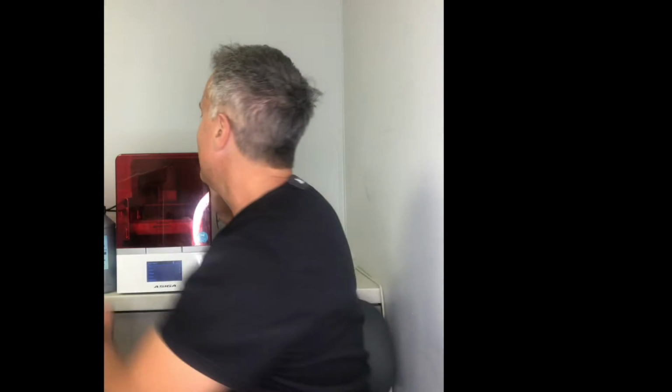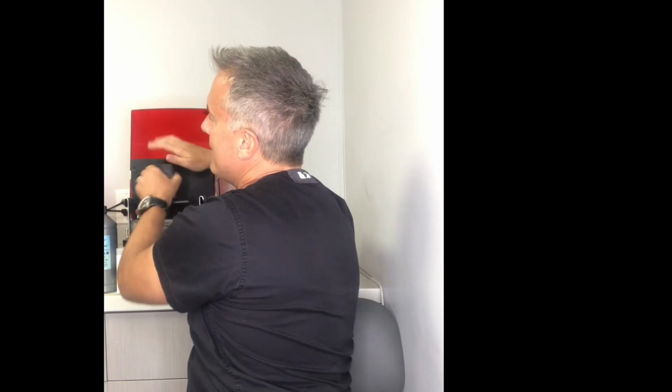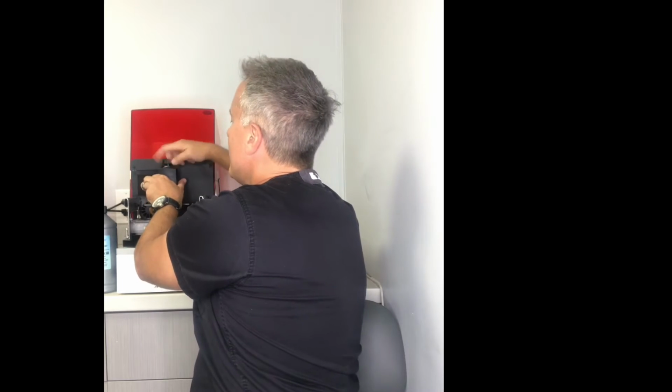So when you're dealing with printers that have a very small XY resolution, you also have to deal with a smaller build plate. The Asiga Max actually has a pretty decent size build plate. It's about 80 by 140. So it's a little bit bigger than an iPhone, definitely big enough to fit 2 models at a time. But one thing that I really love about the Asiga, which I think a lot of printing companies have kind of tiptoed around, is the Asiga is a completely open source printer.